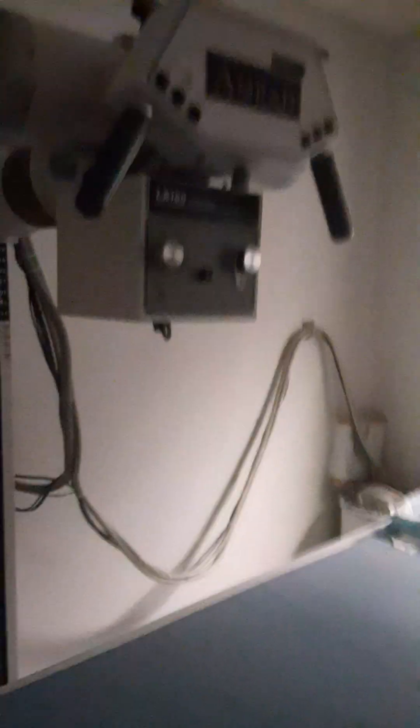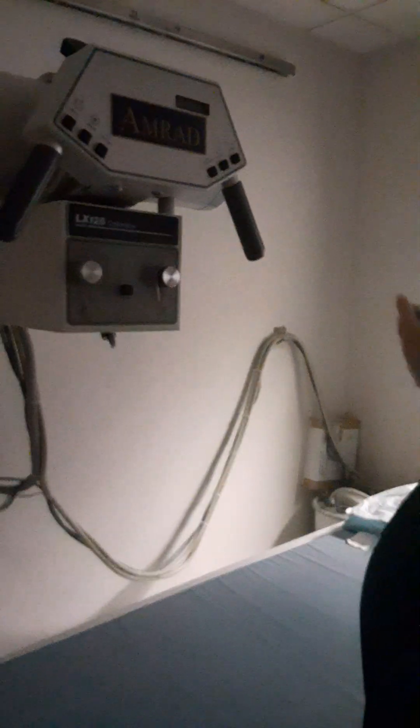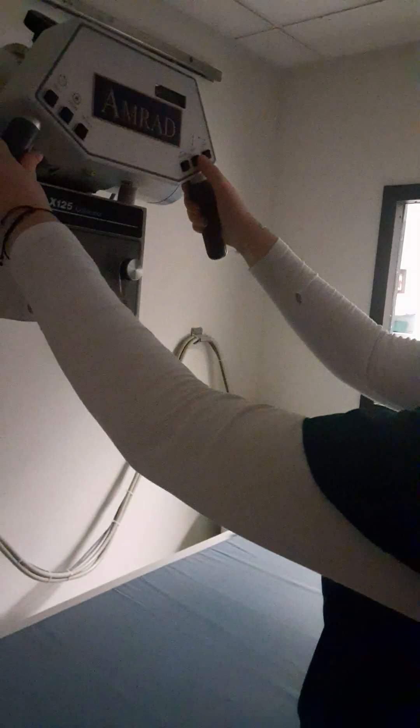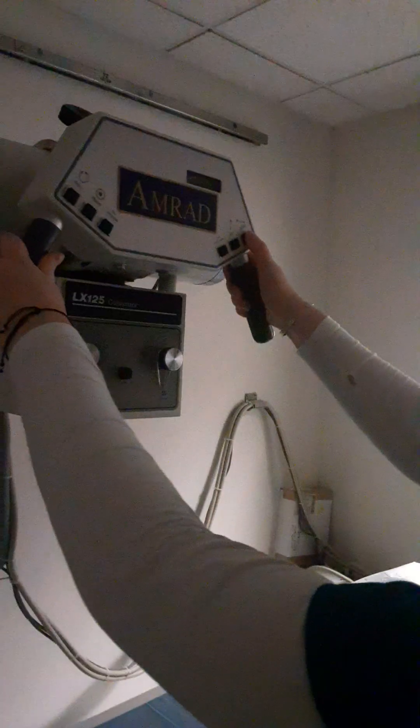Now that we're at table bucky, we can move our tube longitudinally down so we can marry up to our actual table bucky. So longitudinal and on down.